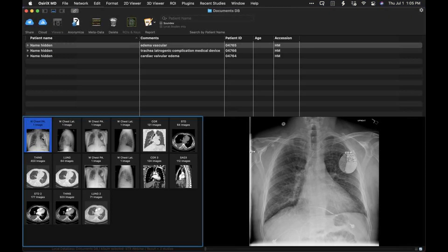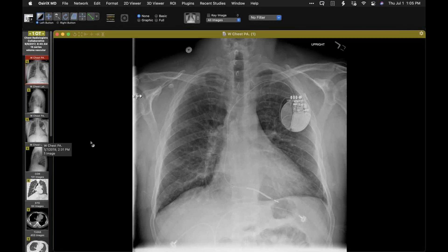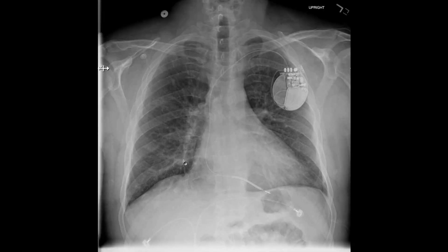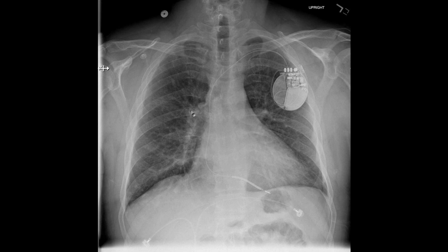Let's go back in time to this patient who's got a pacemaker device. The findings here are really subtle, but you'll see when I show you imaging exams from later on in 2017 that there is a peribronchial fluid cuff or two perhaps in the right lung, and I'm not sure if there's a few septal lines in the right lung at that time, but it is asymmetric — right rather than left.